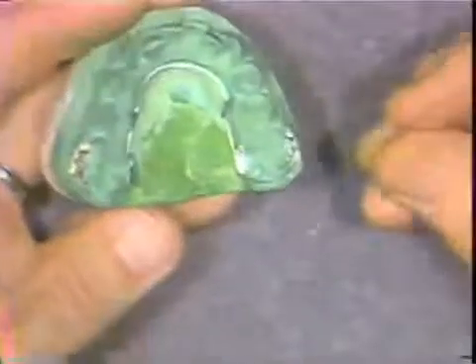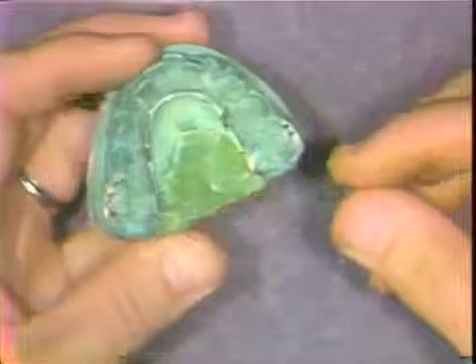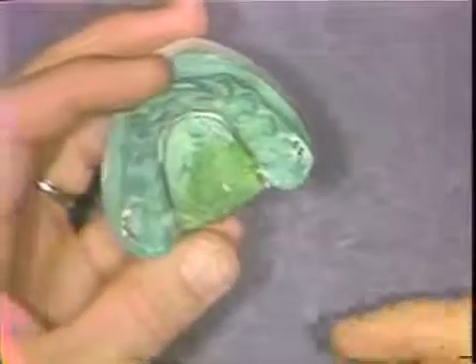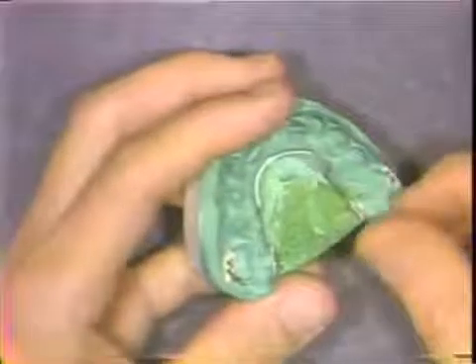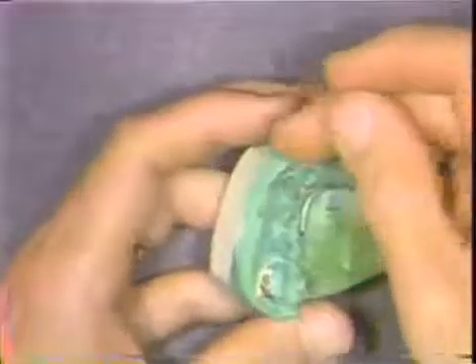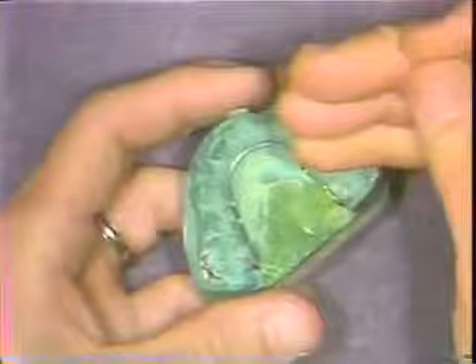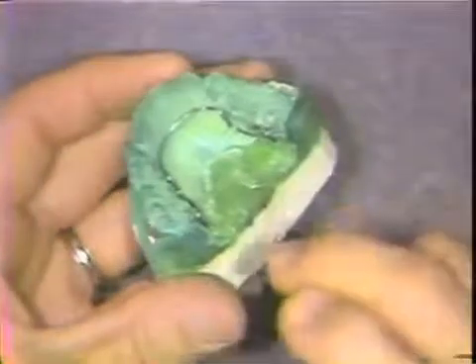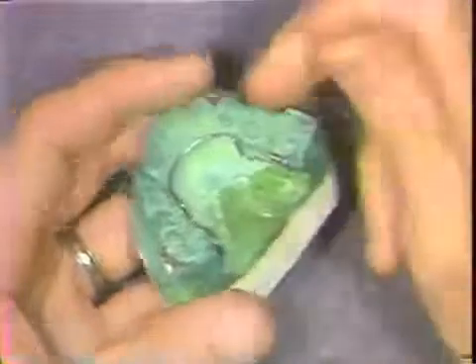A piece of 012 ligature wire is passed beneath the lingual arch anterior portion, and slid down along the lingual surface.